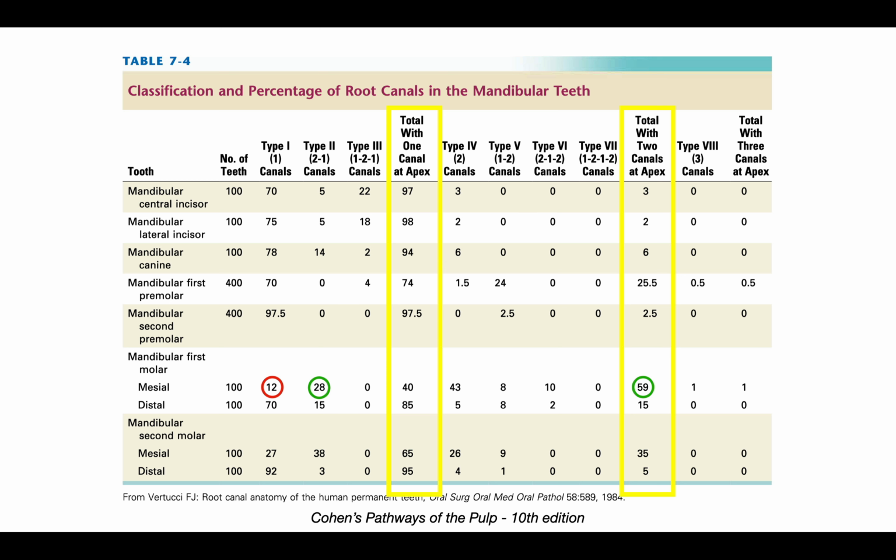All right. Now, very important. These joining mesial root canal configurations are the #1 site of instrument breakage. Oftentimes, an improper or an inadequate glide path is prepared with hand files, and then rotary instruments are introduced and kind of forced down, because what happens is the mesial buccal canal will oftentimes merge with the mesiolingual canal, and that point at which it merges is a very, very frequent site for instrument breakage.